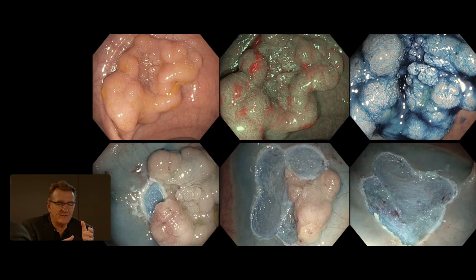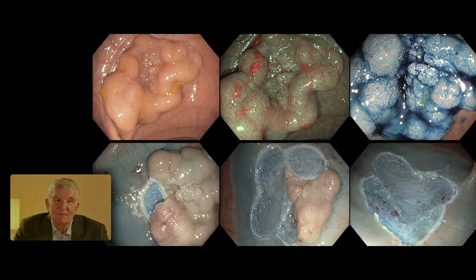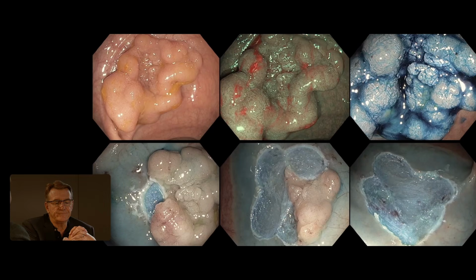So I don't rely so much on it, because there are other reasons for non-lifting; you can have extramural injection. There are lots of reasons. So it has to be factored into the decision-making process, but it doesn't stand alone. Okay, good. So I love that image.